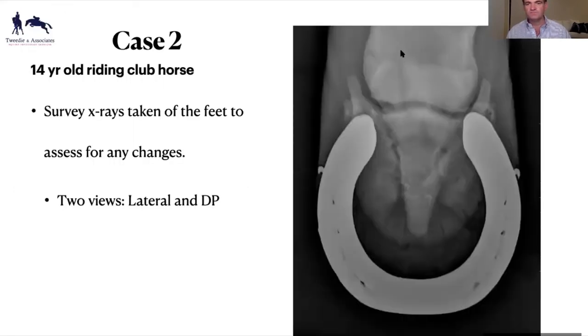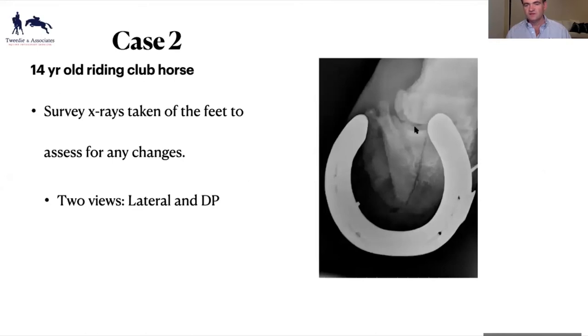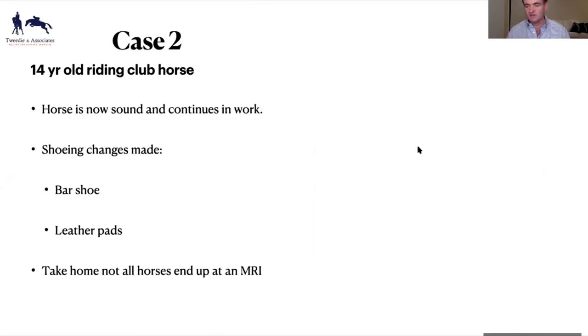We took some more views and you can see the fracture line. The horse is now actually sound — it has a bar shoe, leather pads. The take-home is sometimes we don't end up at an MRI. I'd probably love to see an MRI of that horse's foot to see what the pathology is at the back, but some horses even with changes in the back of their feet can actually get back and do the job they're required to do.